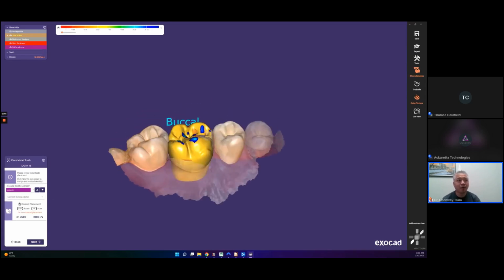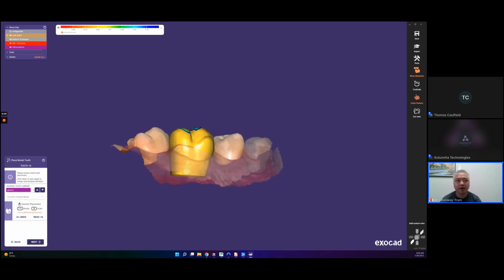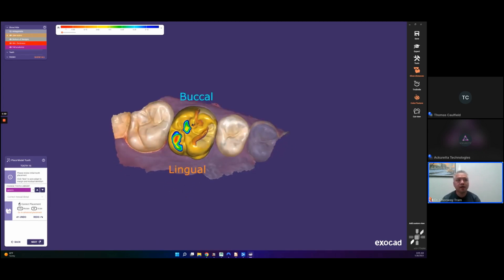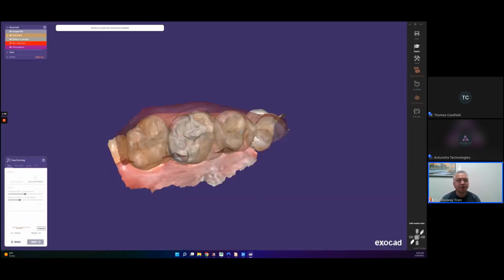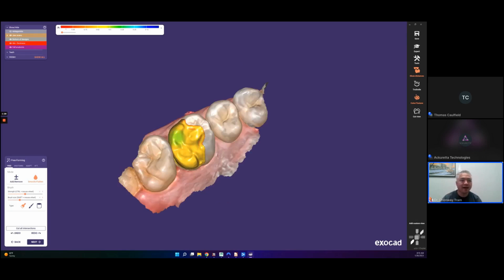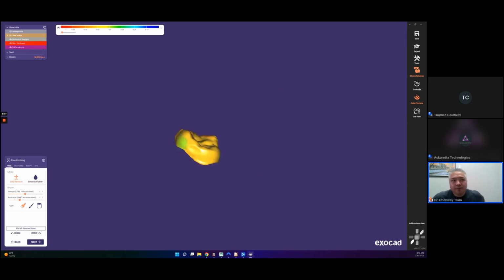So the idea is simple. Mark your margins, right? Get a basic outline of the tooth shape, which is what you see right here. Get a general basic tooth shape into the area that fits the area. And then once you go through the program, AI is going to fabricate something very similar to what you want. Some mild occlusal adjustments here just to make sure that it fits pretty well. But for the most part, that's it. For these restorations, I tend to make the occlusion just a little bit thicker, just to have a nice dense fill, and then adjust it and try it in the mouth if we need to.